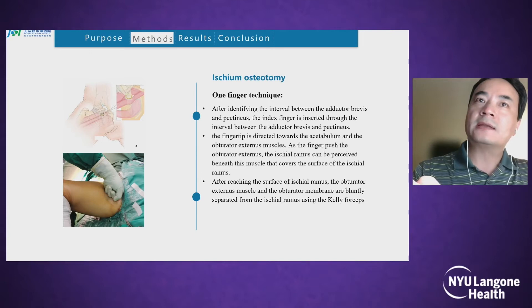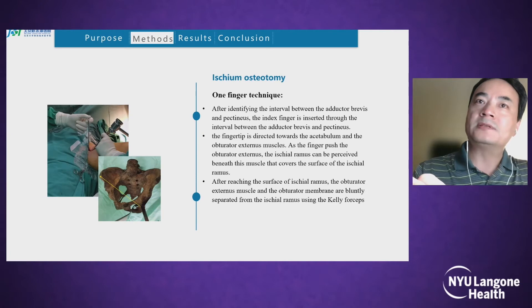The fingertip is directed towards the acetabulum and obturator external muscles. As the finger pushes the obturator externals, the ischial ramus can be palpated beneath the muscles that cover its surface. After reaching the surface of the ischial ramus, the obturator externals, muscles, and the obturator membrane are bluntly separated from the ischial ramus using Kelly forceps.